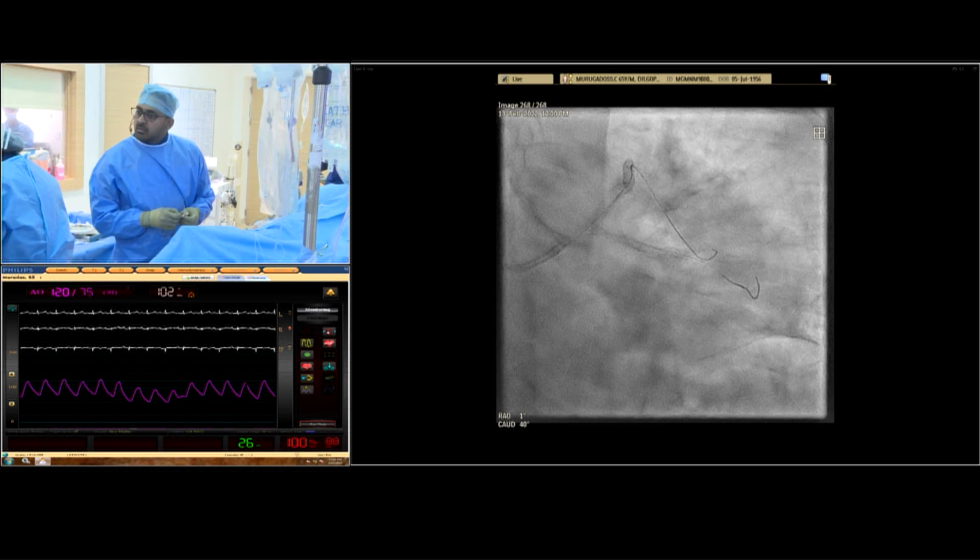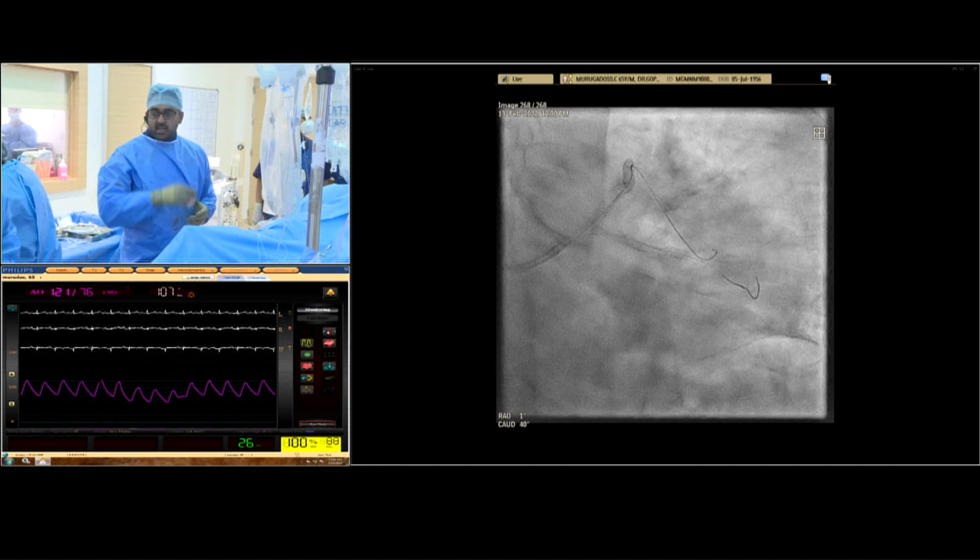For anchoring, we have only this. 3-5-12. 3-5-12 to the LAD.